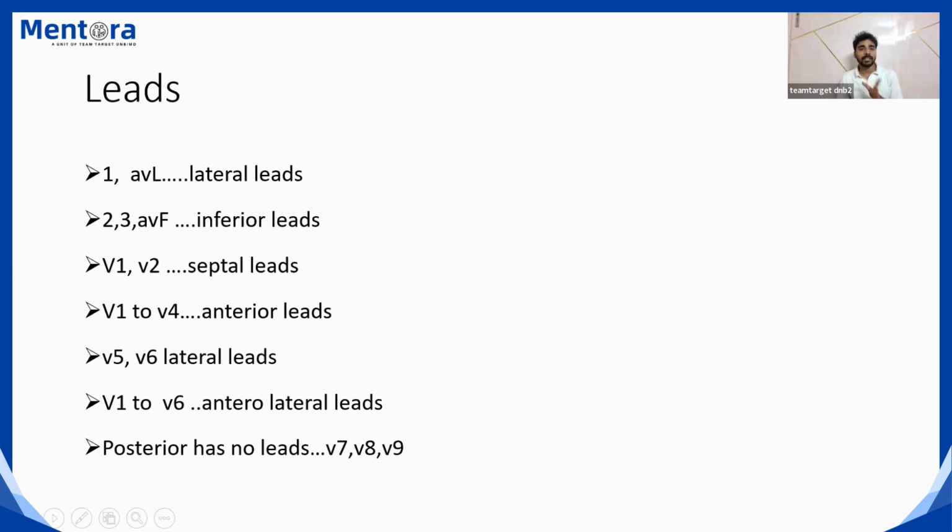No need to remember everything. Just remember this slide. This slide is very important clinically. If any problem occurs in these leads, that part of the territory is involved. So that's what is important.